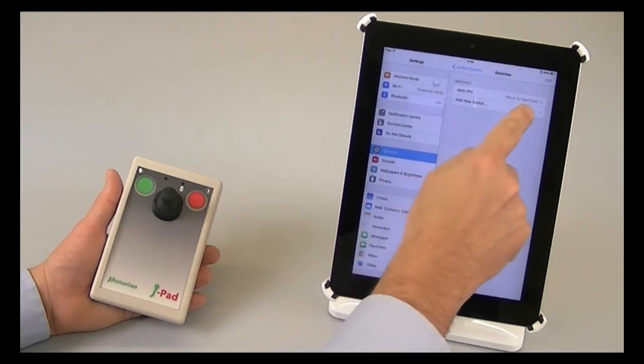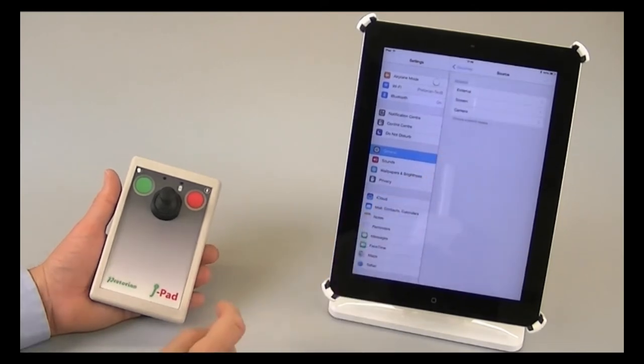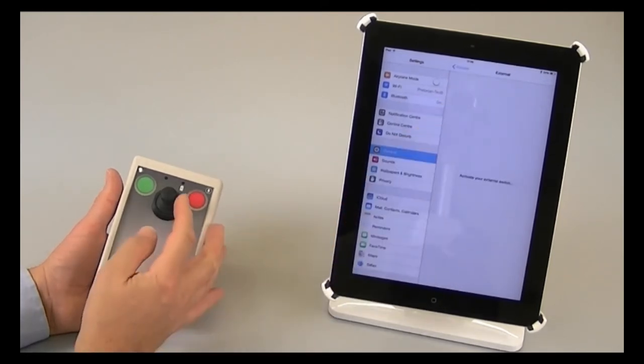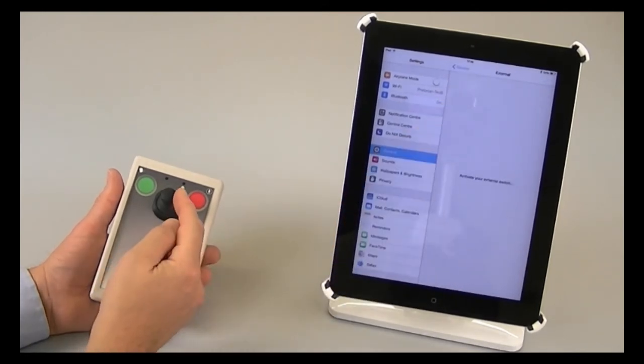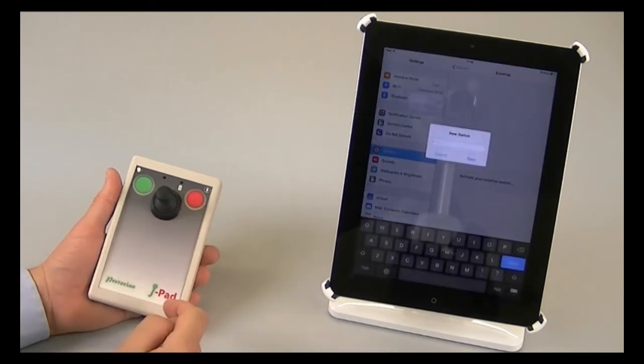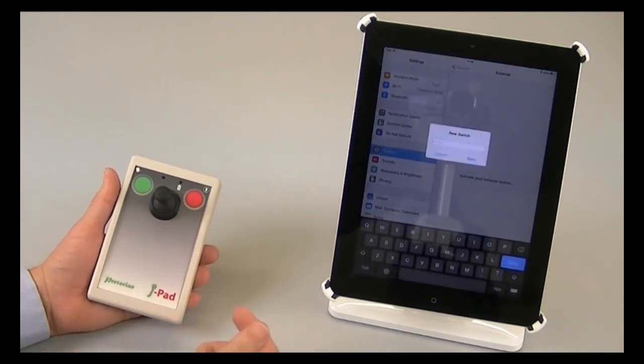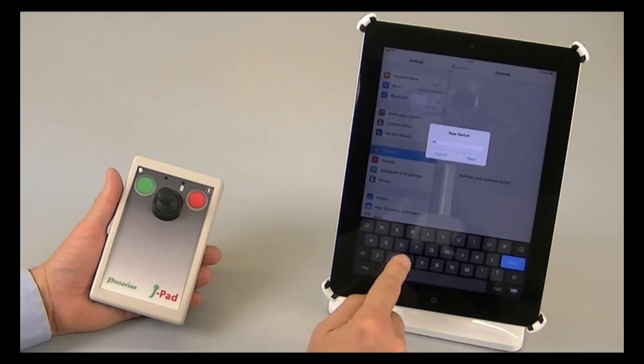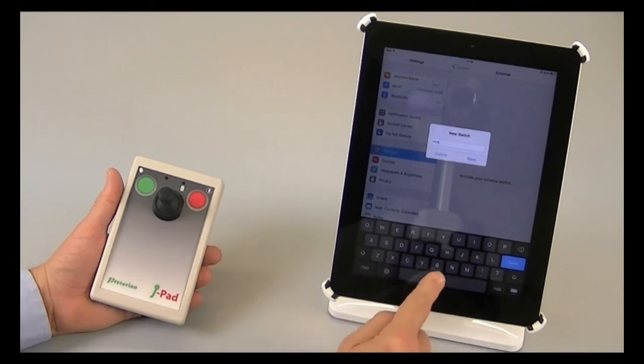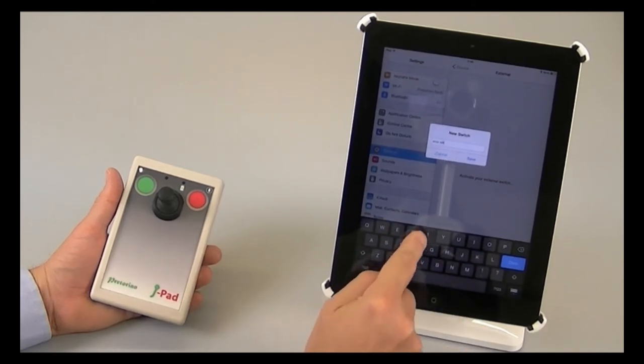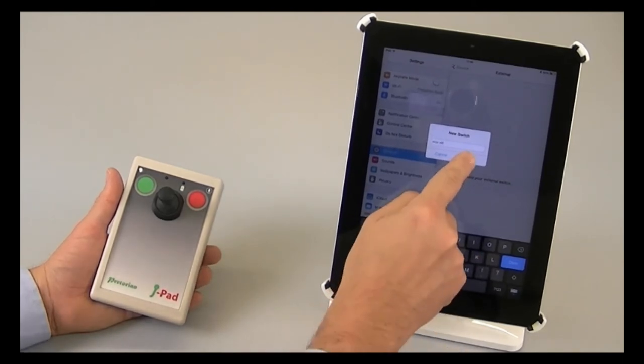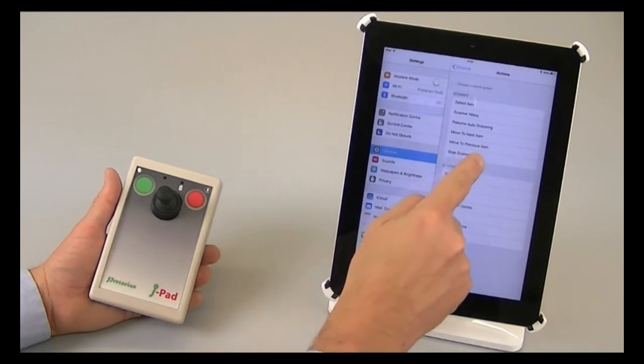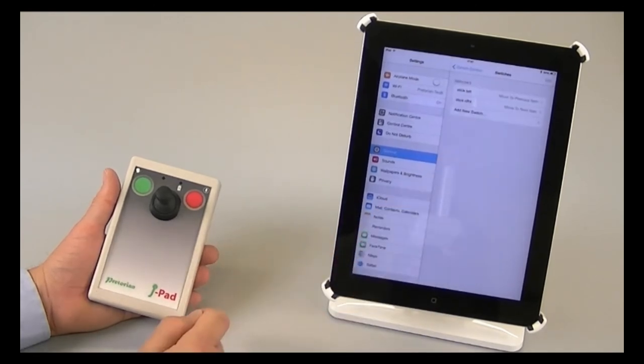I'm now going to repeat the process, but this time move the stick once to the left. Now I need to type its name, and I'm going to call it stick left. And I'm going to assign it the function move to previous item.